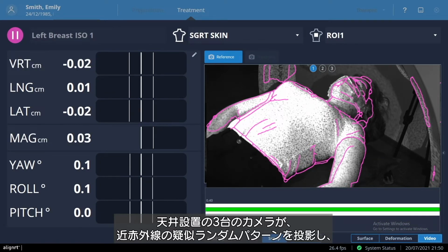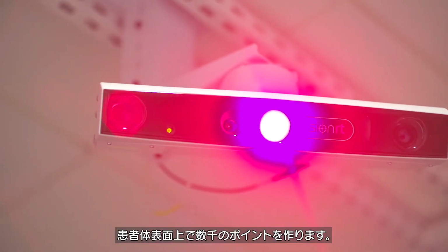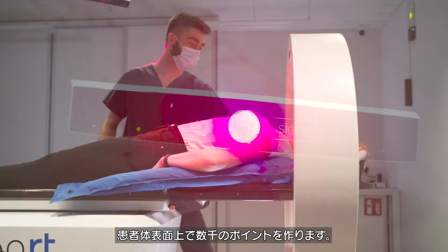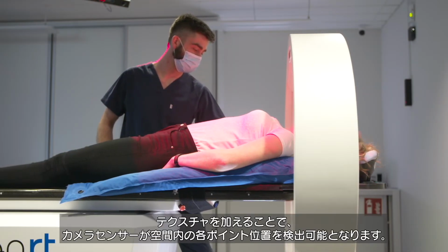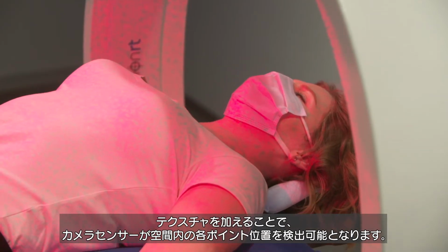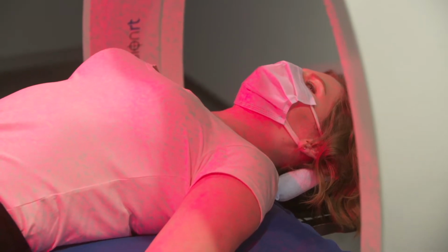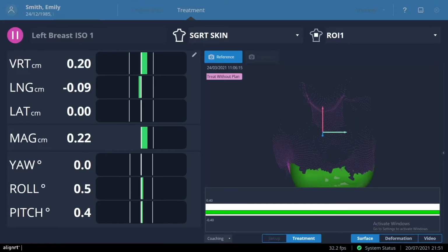The 3 ceiling-mounted cameras project a near-infrared pseudorandom speckled pattern onto the patient's surface, which consists of thousands of points. Texture is added so that the camera sensors can detect where each of these points are located in space. The AlignRT software generates a live surface of the patient.